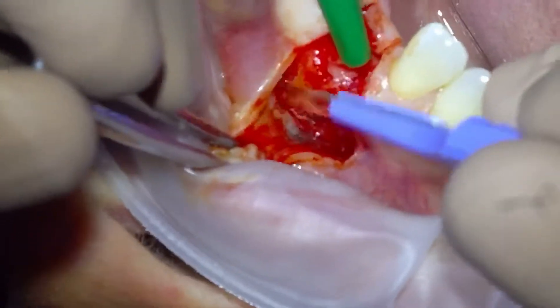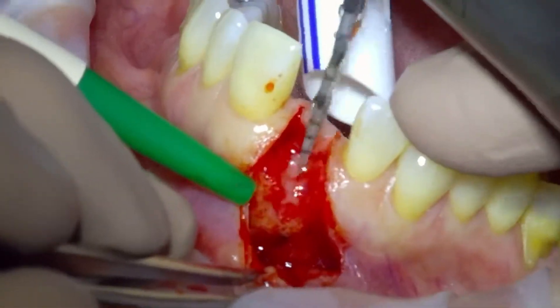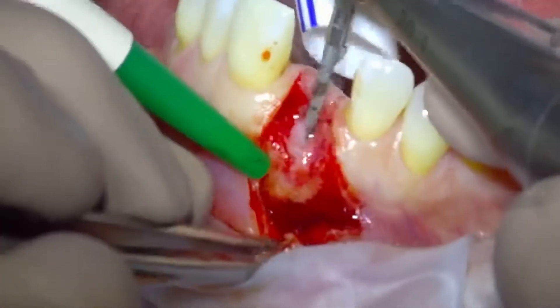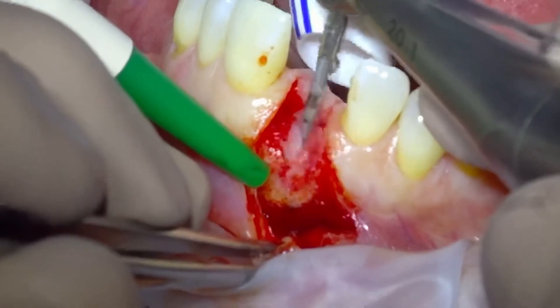You can see here amalgam tattooing — although there's no amalgam debris, we've got amalgam tattooing in the bone. And then we can start our pilot osteotomy with our little lindemann-type burr.